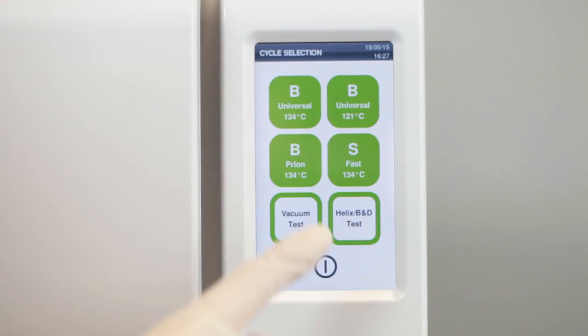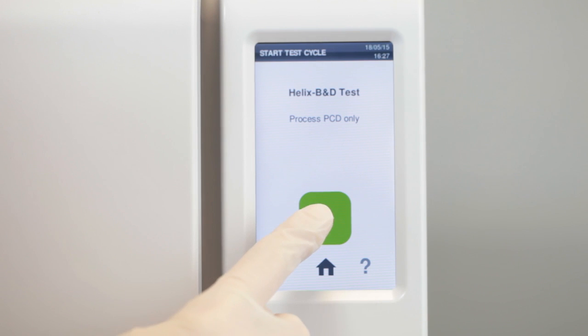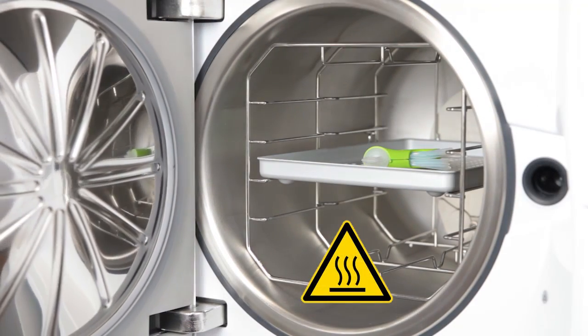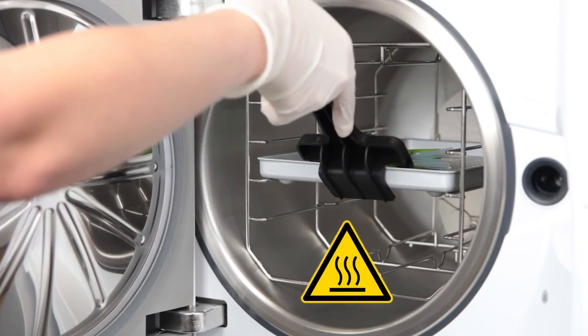Close the door and select the Helix test from the cycle selection screen. As soon as the test cycle is complete, remove the test device from the sterilizer.